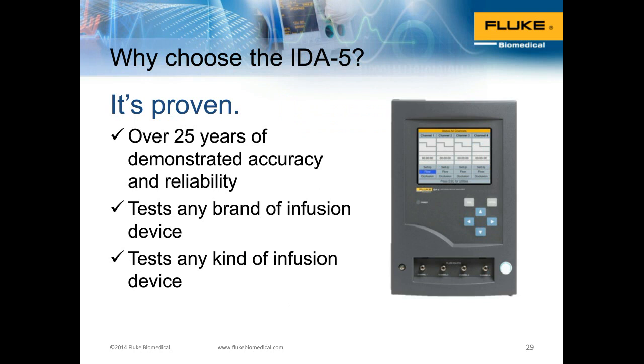So no matter what the OEM service manuals say, you are free to select the method you're going to use to test infusion pumps. You may be required to enter data that you're reading off the infusion analyzer, but you should be free to select any method unless the OEM says you must use the specific method and no other. So please always keep that in mind, because that has caused a lot of confusion over the past years as to whether analyzers can be used with certain brands of infusion pumps.